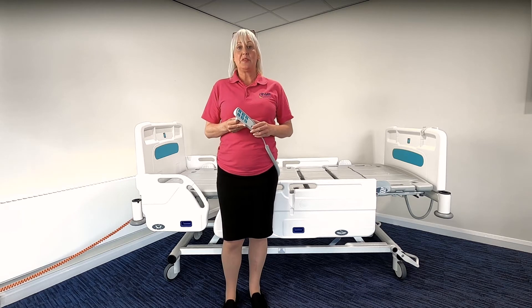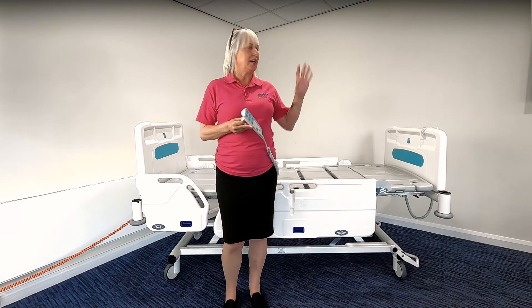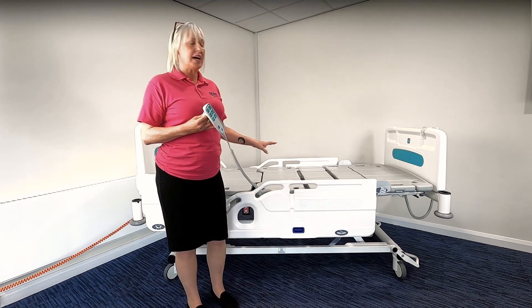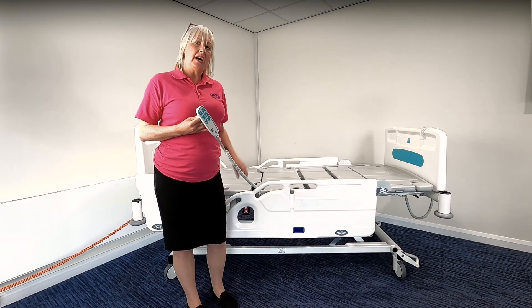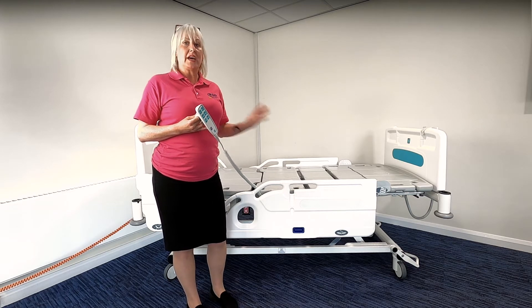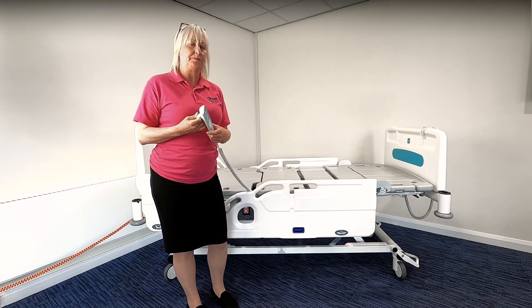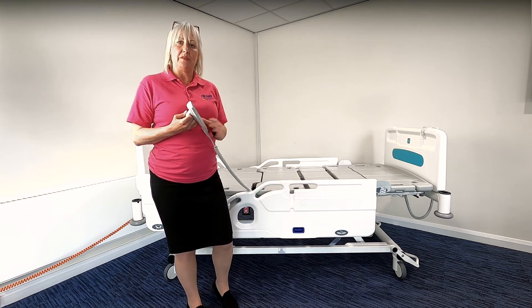As part of the bed demonstration, we're going to go through the handset controls. The Innovate IQ bed has two handsets: a nurse handset which has full control functionality and a patient handset which has limited functionality. Unless you have purchased the Innovate IQ bed with the split side rails with integrated controls, in that case you would have the patient controls in the side rail rather than the handset provided. The functionality however is the same.